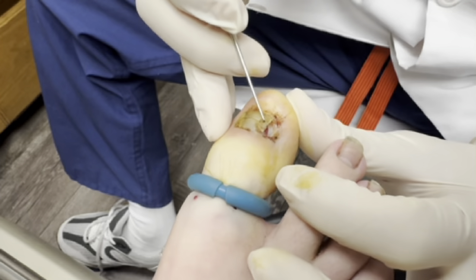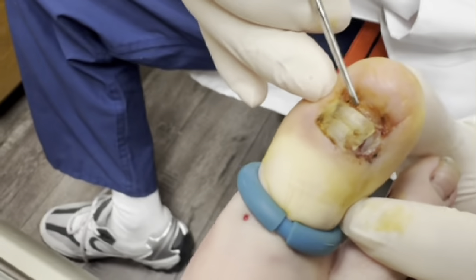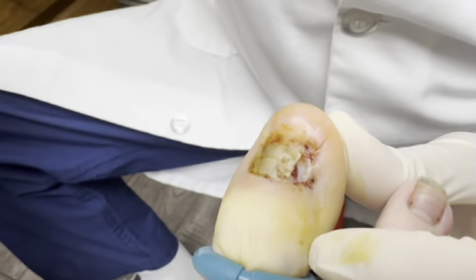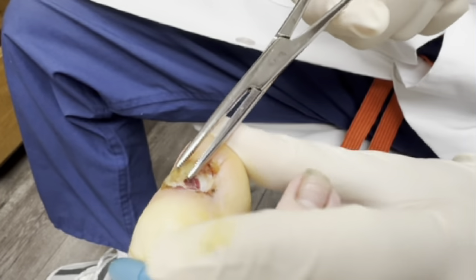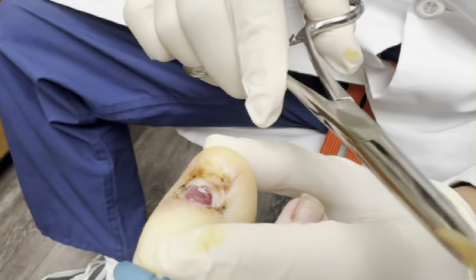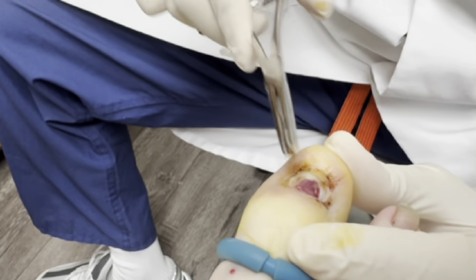It started having pain. Dylan, you're having pain or no? No? Okay, well he's a pretty tough guy. You can see I'm going to take the nail off and there's some strange tissue underneath, so I wanted to take a little sample to send off to the laboratory. It looks like what we call a granuloma — a reaction from trauma, the body trying to protect itself, causing a little tissue buildup. Oh, there's that nail coming off.